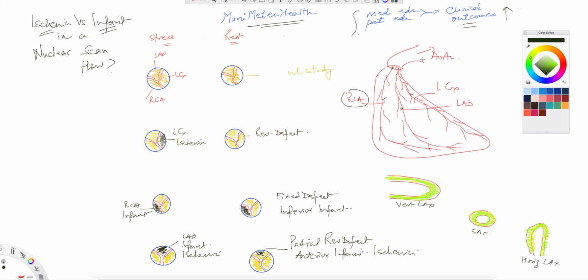The heart supplies the body, and again for the medical students, just so that you know that there are two sets of coronaries. The left will divide very early on and the right will just continue as is, and of course supplies the right versus the left respectively. Okay, so having said that, now you understood, basically the nuclear scan is defined where you actually perform radioisotope stress test, where the person walks on a treadmill or is given a pharmacological test. We're not going to go in detail here regarding those testings, but essentially we want to show you some of the schematics here. So during the stress, after the patient is rested, there are two sets of images that are taken. One is a stress image and second is a rest image.